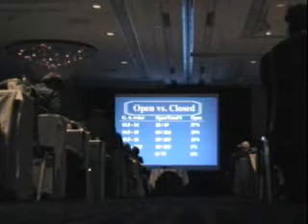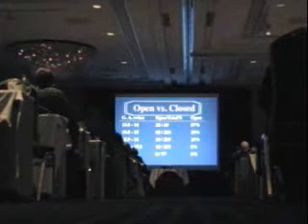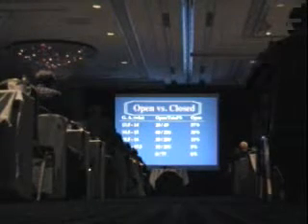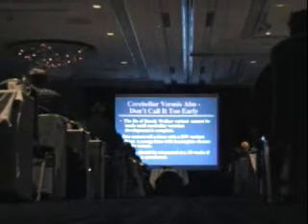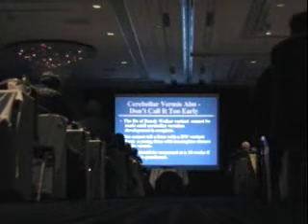So if you're worried at 14, 15 weeks, somebody coming in for an amnio perhaps, and you see a little keyhole business, just say, well, we're not seeing the cerebellum really well, come back for a full survey at 18 weeks, and that's perfectly acceptable. And I would not even mention the word Dandy-Walker if you're going to scare the patient half out of her wits, and it's not really fair.